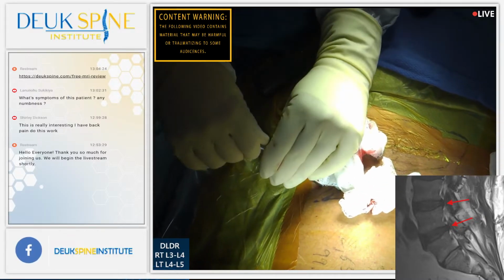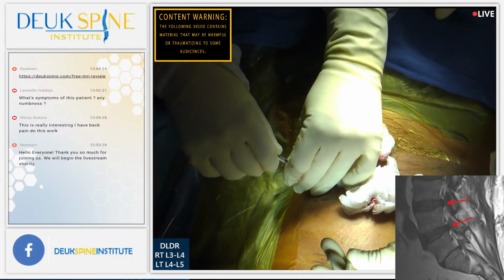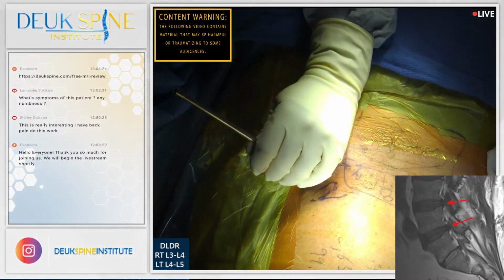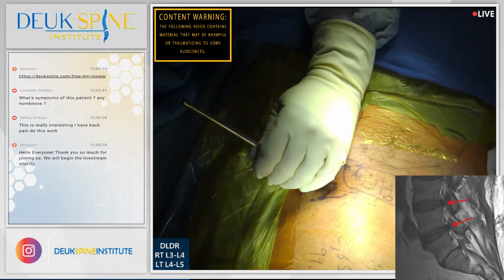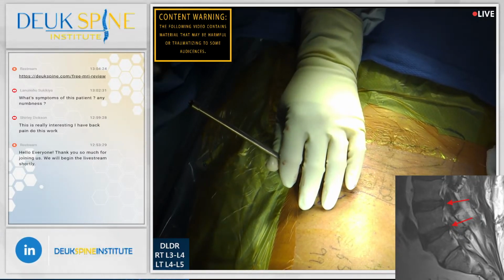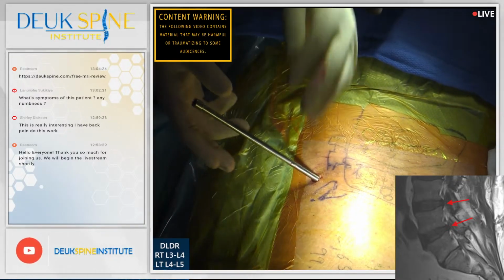It's bloodless. There's no hospitalization. There's no narcotics. There's no bleeding. In 20 years, we've never had a surgical complication, not a single one. No infection, no nerve damage, no spinal fluid leak, nothing. No adjacent segment disease. We are now inside the tear.